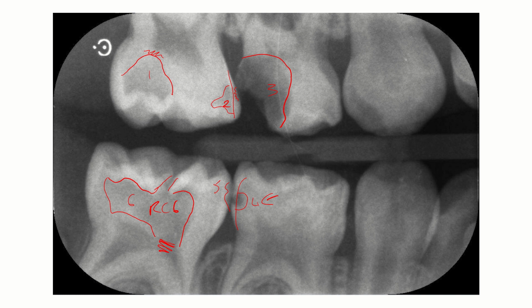So I hope that's helpful in terms of feedback. I would really encourage you to look at as many x-rays as possible. Every time you see a patient, regardless of what they're in for, look and see if they have any previous radiographs that you can use. You can practice writing reports on any radiograph, doesn't matter whether you took it or not. Just look at them, identify if you've got spaces in your appointment book, perhaps just go for some random x-rays that you can find for patients that are in your appointment book, and ask the tutor that's with you if they can have a look with you and see if they agree with what you're saying.